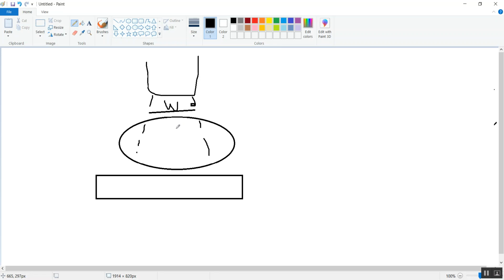But if we increase the scan slice thickness so the slice width increases to 10 millimeters, you scan a greater area, 10 millimeters of the patient. So the exposed area in the patient will be higher. So the slice thickness is very important to calculate the dose of the patient.